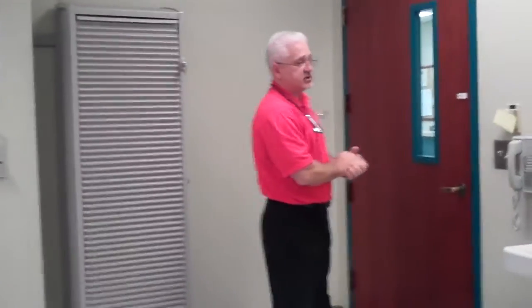At this point, I would go over to the sink, I'd wash my hands, and then I would proceed to the patient's chart, and I would chart what I did with the patient. I chart their heart rate pre and post, respiratory rate pre and post, peak flows pre and post, breath sounds pre and post, and what else did I miss? Heart rate, respiratory rate, sat, color, level of dyspnea pre and post, and if the patient had any kind of adverse reactions to the therapy.